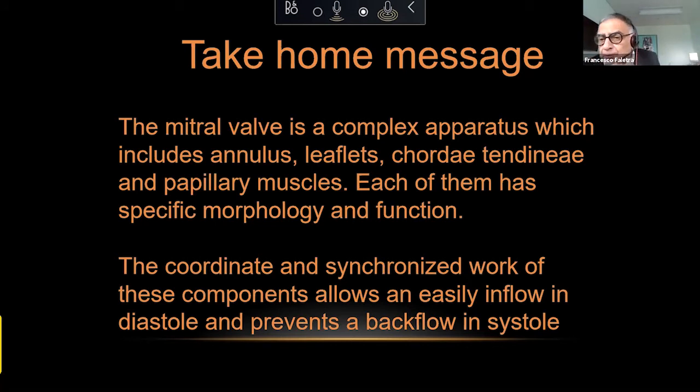It's present in normal hearts, and also in mitral valve prolapse. And a recent paper of Dejgaard, it's difficult for me to pronounce the name, showed what?